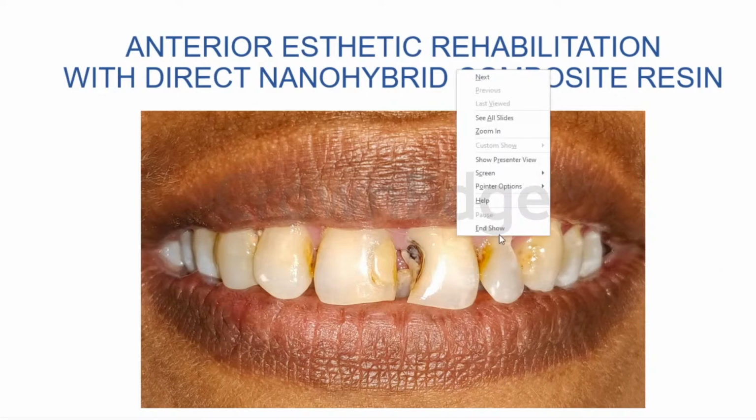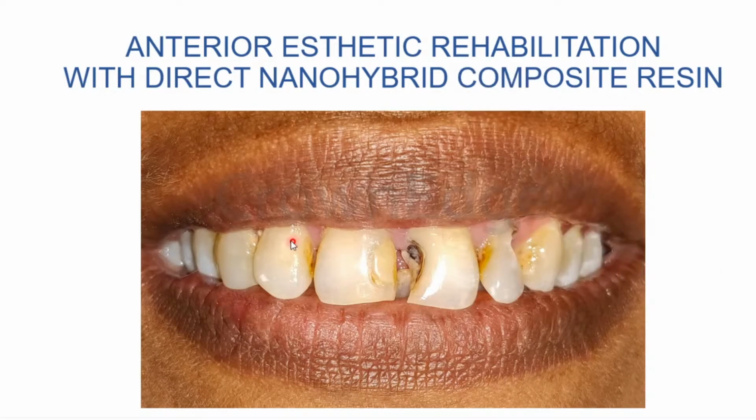So let's just get my pointer out over here. You can see that there is some amount of surface alterations in the mesial side, which can be just polished a little bit, roughened and restored with some composite resin, nicely polished so we get a good gloss at the corner of our smile line.